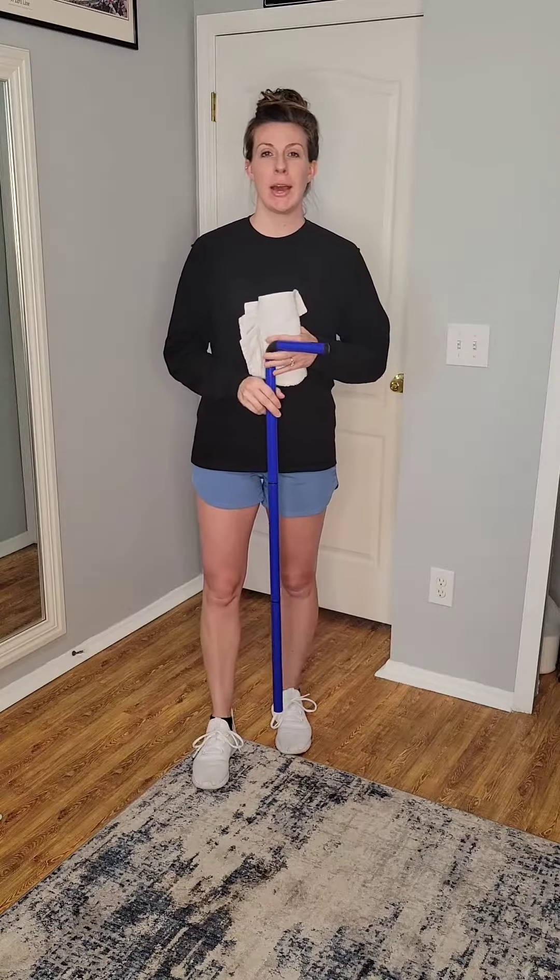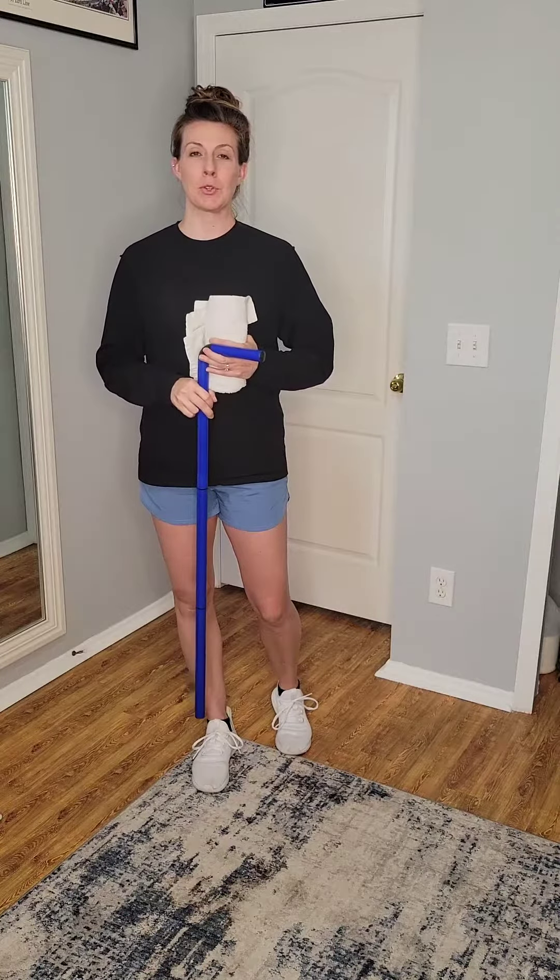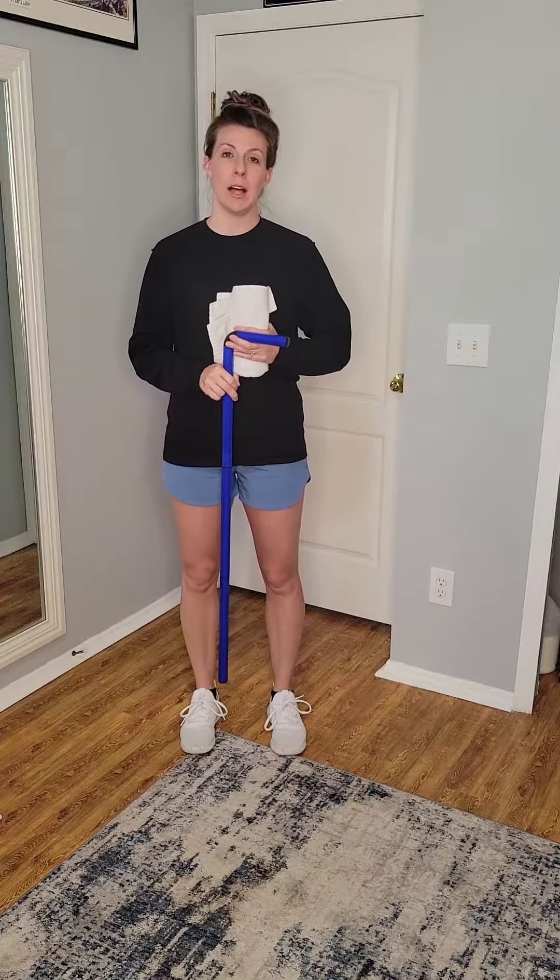Hey everyone! I'm going to show you how to use the shoulder wand here to perform shoulder external rotation active assisted range of motion while the arm is in neutral alignment.